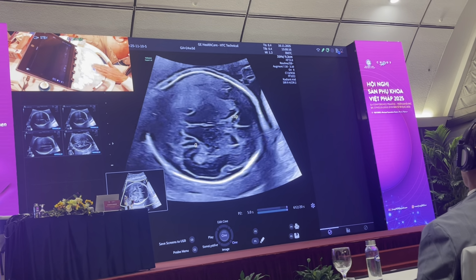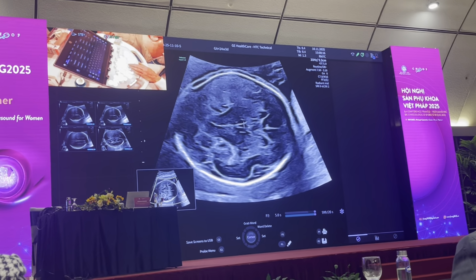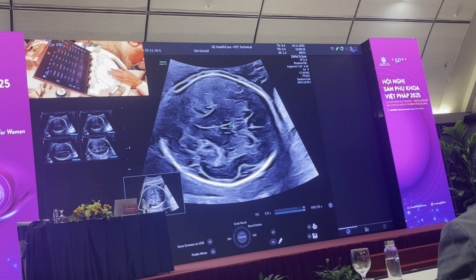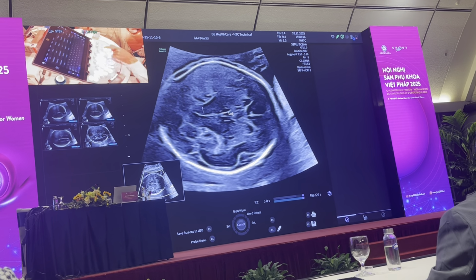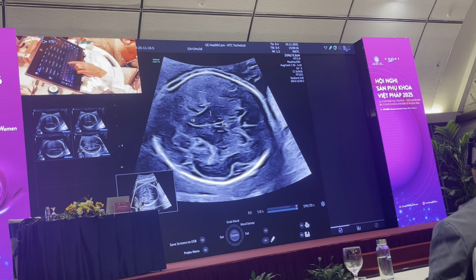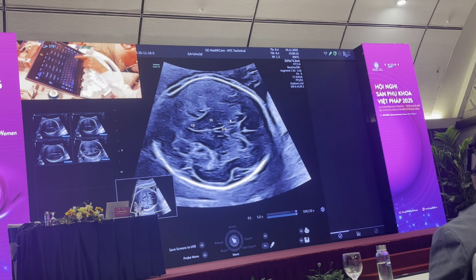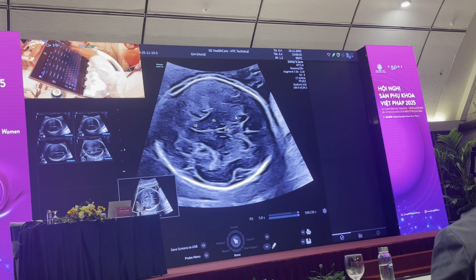When I'm looking at this here, I'm asking myself the question, is the third ventricle enlarged? So this is, to me, okay. As I look at the third ventricle, I bring down the size of the third ventricle in view here. This here is the cerebral peduncles, also called the mesencephalon, and this here is the thalamus. The more echogenic structure that lies anterior to here is the caudate nucleus. So we mark this here, but this here is the caudate nucleus.